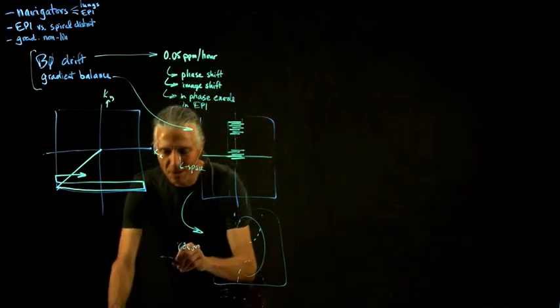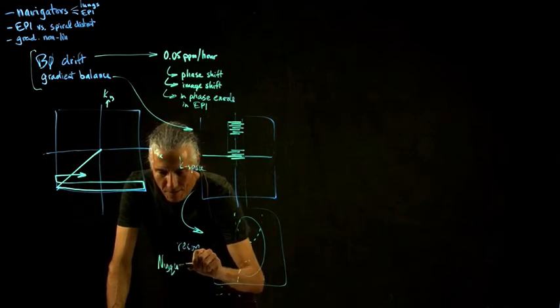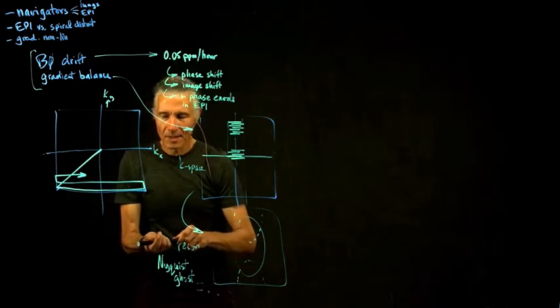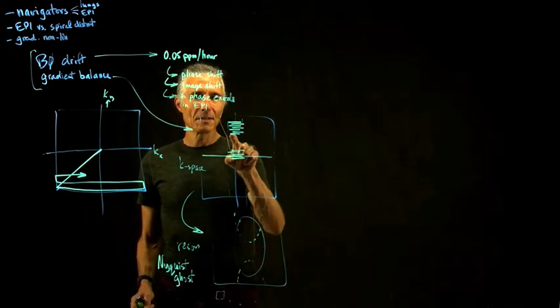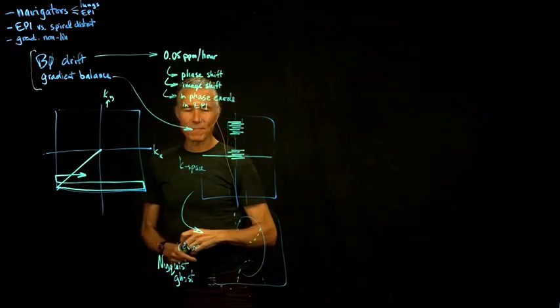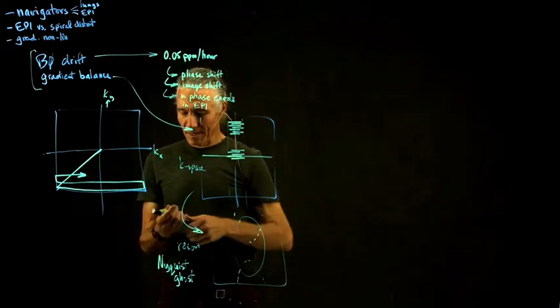And that's called a Nyquist ghost. The reason is that it's a ghost caused by something occurring at the highest spatial frequency. So it's a defect that is just between adjacent spatial frequencies. That's something that we need to correct.